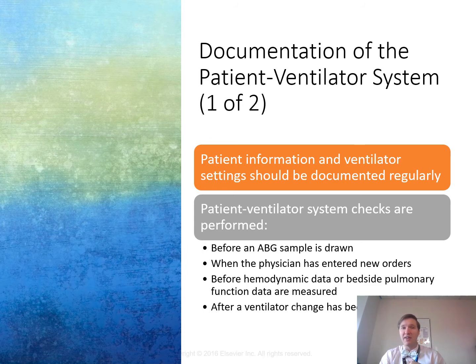So that's one of the things that we have to look at here: once we do it, how did the patient interact with this? Right? And this procedure can vary, as we just talked about. And then anytime there's a question in whether the ventilator's performance is optimal, we should go ahead and do a vent assessment as well to make sure that the settings are all appropriate and the patient is interacting.